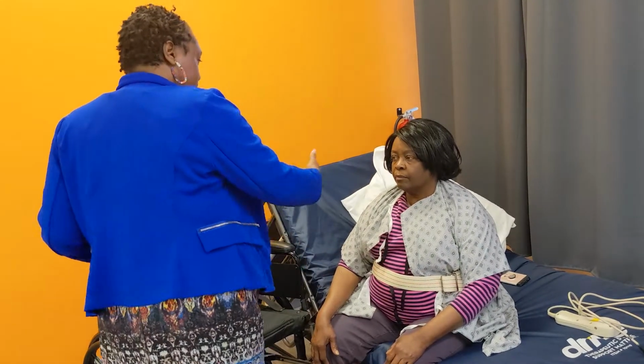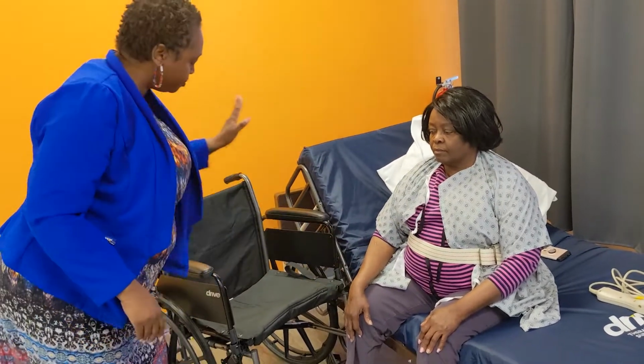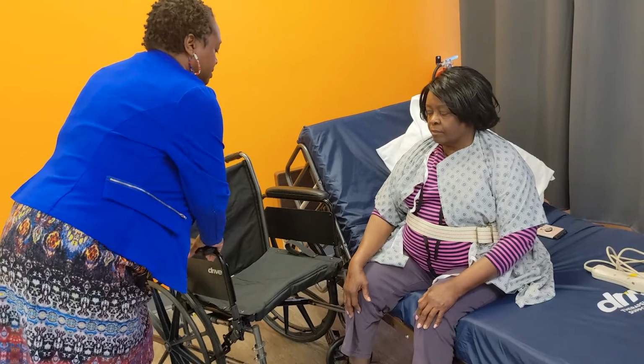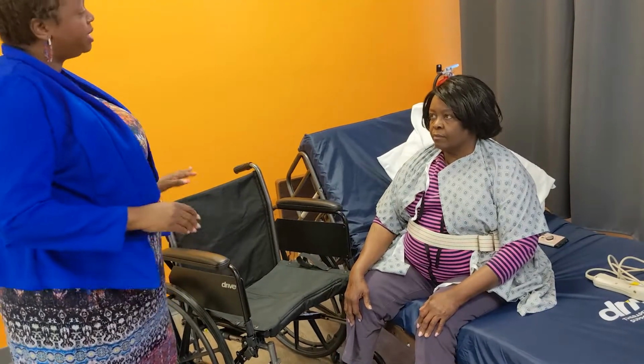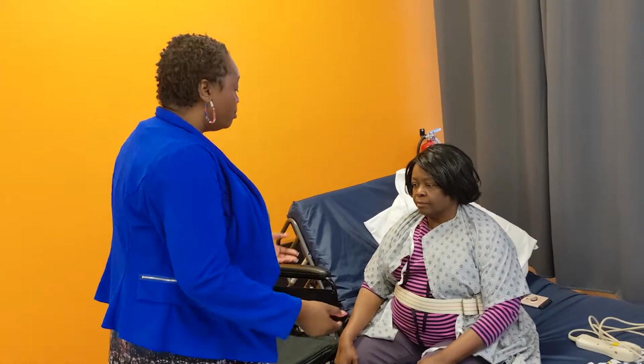And we're going to turn together your body. Don't take any steps. Take this arm and reach for this arm rest, okay? It's called a pivot. And basically, you're to turn your body without taking any steps, all right? So we're going to get real close to each other. Do you have any questions? All right, and I'll repeat it one more time.